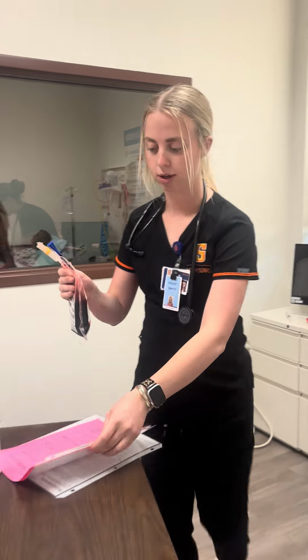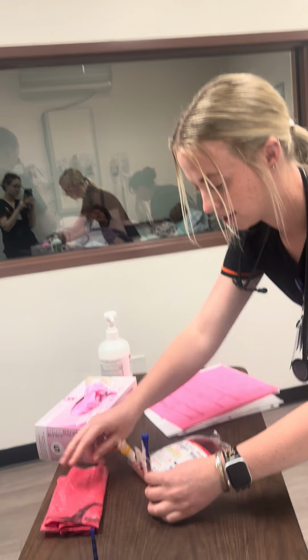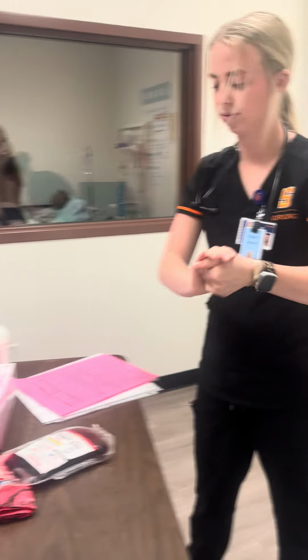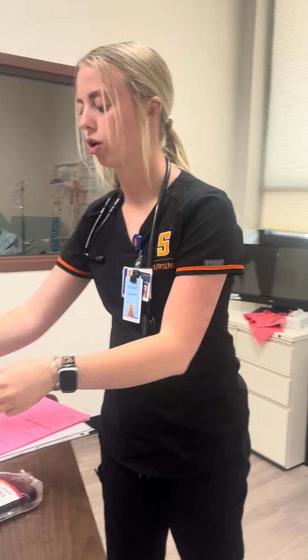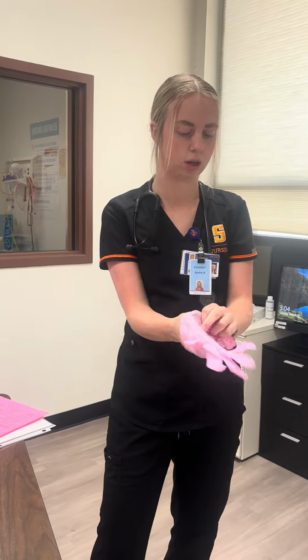So upon coming back in the room, let's pray that this doesn't leak out. I'm going to do some hand hygiene again. So much, it's fine. And before I hook up my blood, I'm gonna make sure that there's no odor, cloudiness, bubbles. These are all concerning signs, and we don't want to administer that blood to our patient.